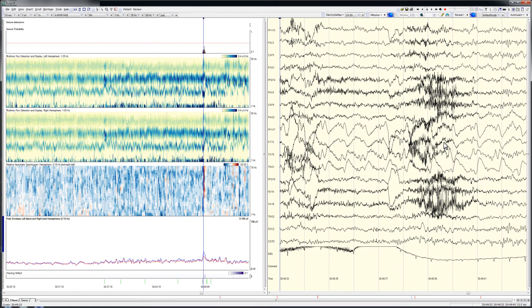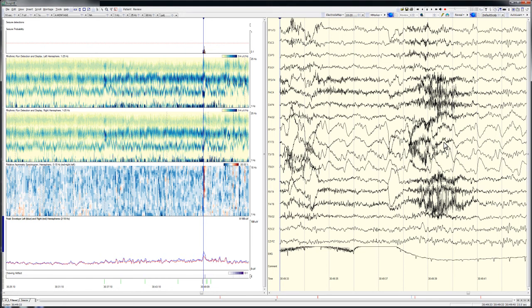Also, several brief runs of high amplitude sharply contoured rhythmic left temporal delta activity were identified. The independent expert's visual review of the entire 38 hour long EEG did not reveal additional seizures. As noted before, the reviewer who performed the visual review of the entire EEG didn't recognize the brief rhythmic alpha seizures, which in this case were identified only through review of the EEG trending graphs. This illustrates the clinical utility of reviewing the EEG trending graphs as a cross-check to maximize recognition of diagnostically important events.